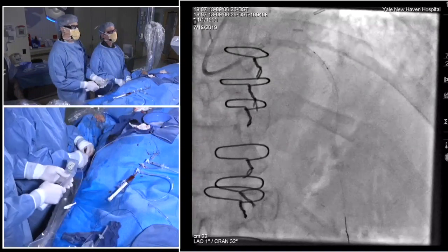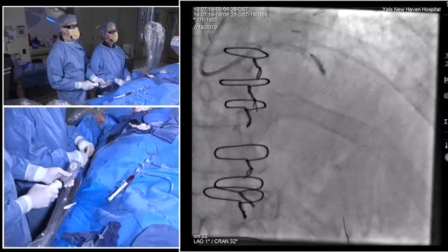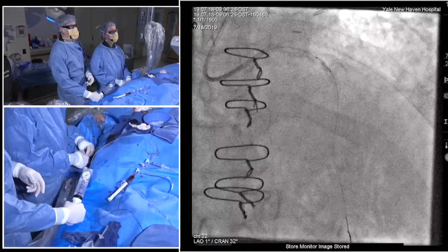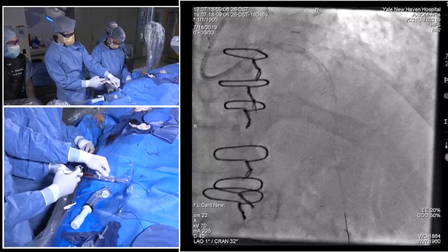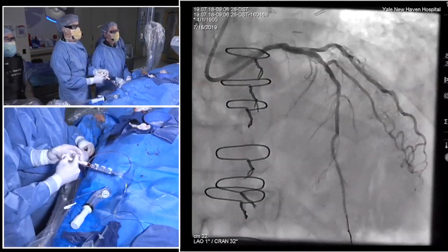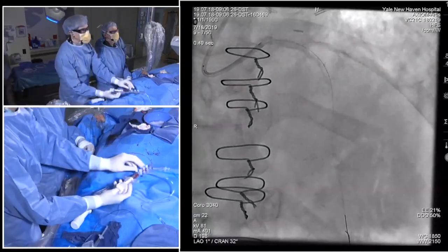The other thing is it can be a helpful marker when you're trying to avoid contrast injections. If you have markers or wires in different branches, you can do a lot of intervention with basically no contrast. That's right. Honestly, in this case, with the slow flow and the LAD, you have stunning in that distribution. If you lose another branch, and the likelihood of losing is low, but a big branch like that diagonal, that's when patients tend to get pretty sick.